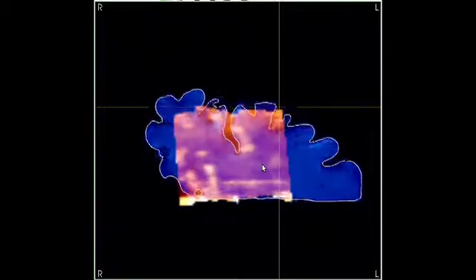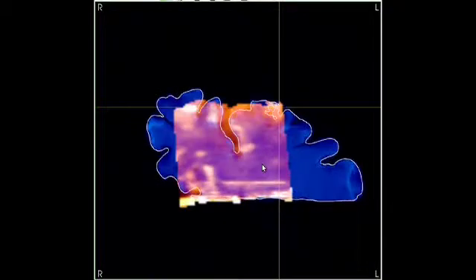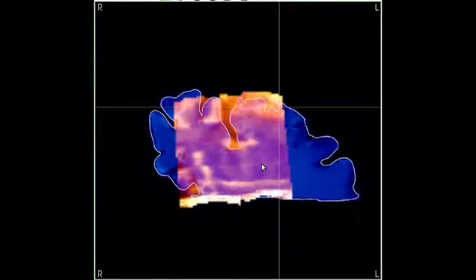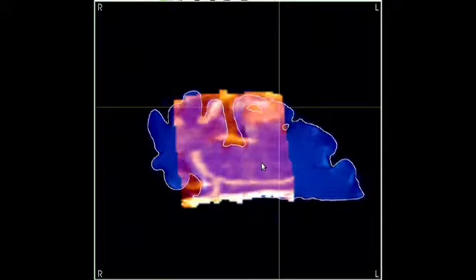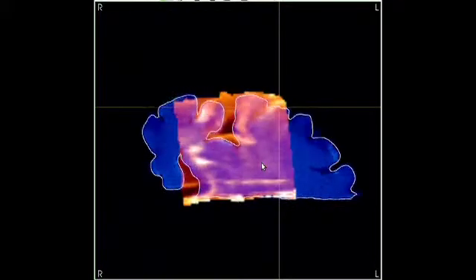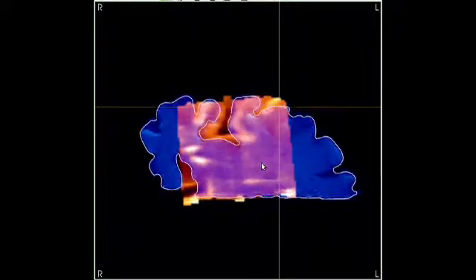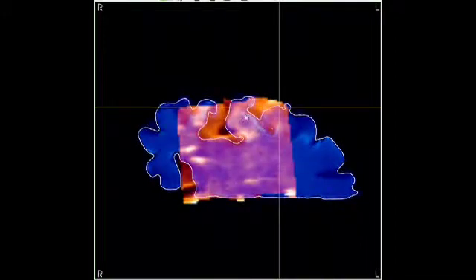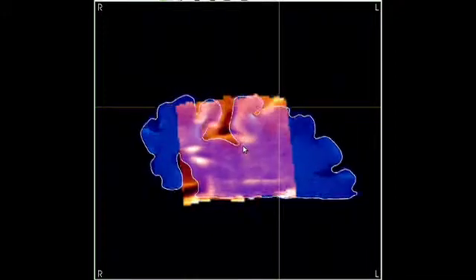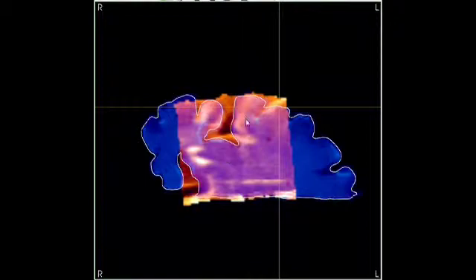We can scroll through the preoperative and intraoperative image slices simultaneously to see some of the areas where the registration is highly inaccurate. This must be corrected if the use of neuronavigation is to be continued.